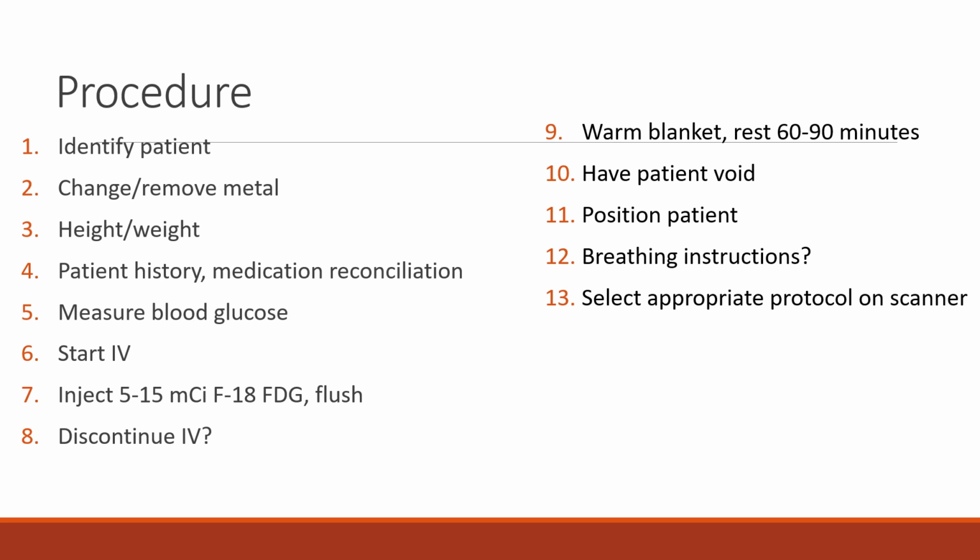The PET scanner looks very, very similar to an MR and a CT scanner to a patient. Most patients cannot tell the difference, and most patients are used to having a CT where they have breath holds. And so they're expecting to have to hold their breath. And if you don't tell them they can breathe normally, then you might get additional breathing motion as they're holding their breath and then letting it out. Their breathing is going to be a little bit more labored after holding it for a while. And so that can create more breathing motion on the scan. So make sure you tell them they can breathe normally and try to relax.